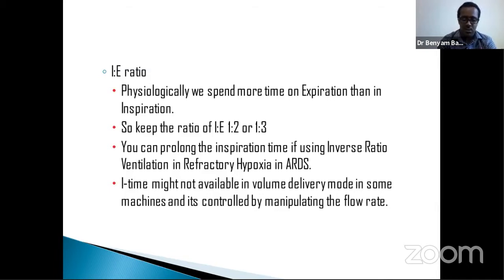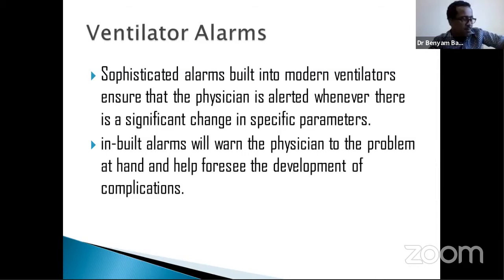I didn't specifically go through that, but indirectly I have dropped certain points on oxygenation, so always keep that in mind. The other important part in the operation of mechanical ventilation is knowing what those alarms mean.